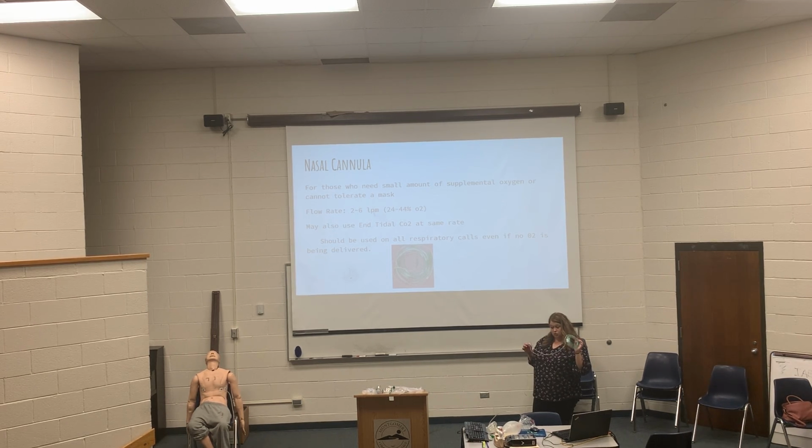A lot of people use these as a norm because they're on continuous supplemental oxygen. COPD patients, heart failure patients, anyone who has any kind of lung disease uses this.